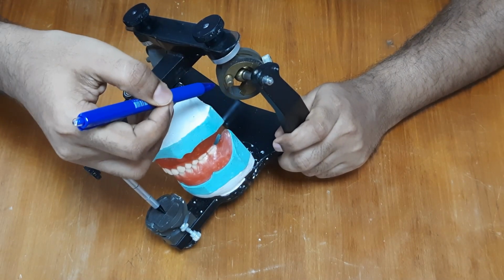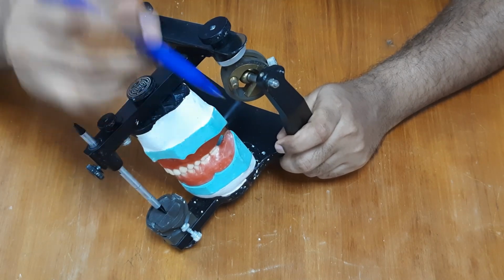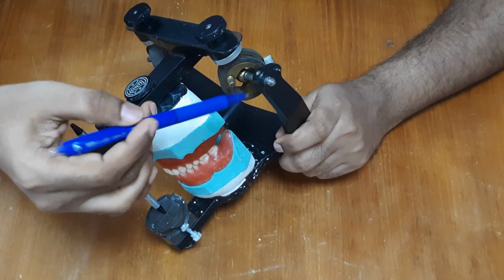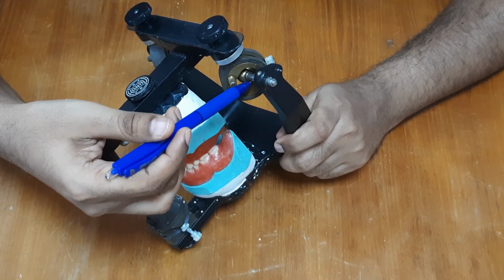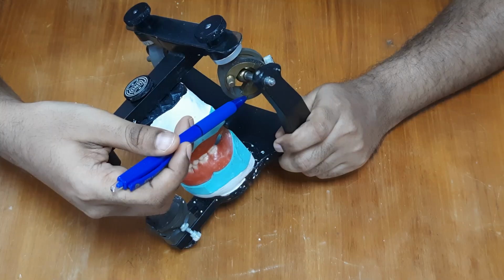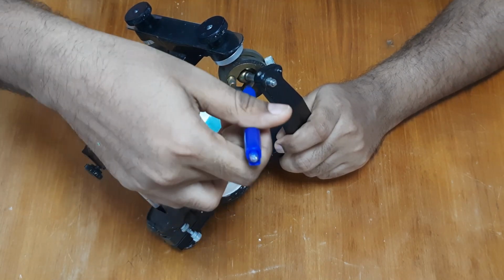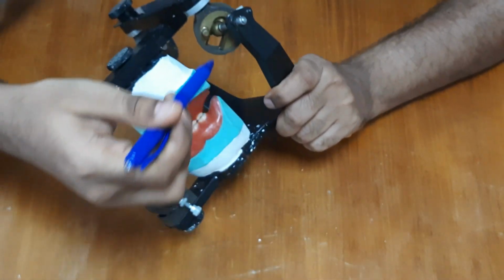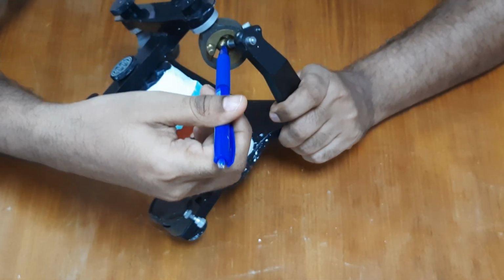This is the condylar guidance, which is attached to the upper member of the articulator. It actually represents the glenoid fossa of the patient. It is a very complex assembly. It articulates with the condylar element, which is attached to the lower member. This is the round condylar element.